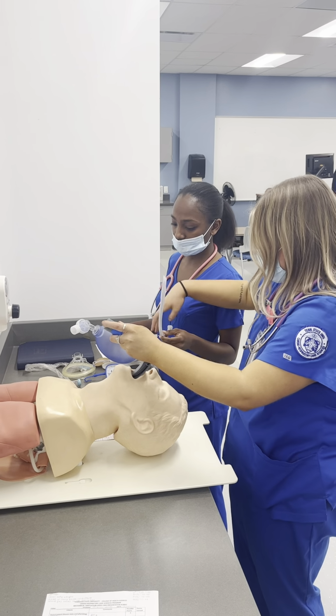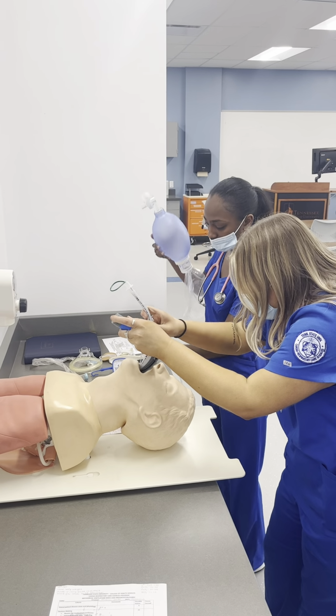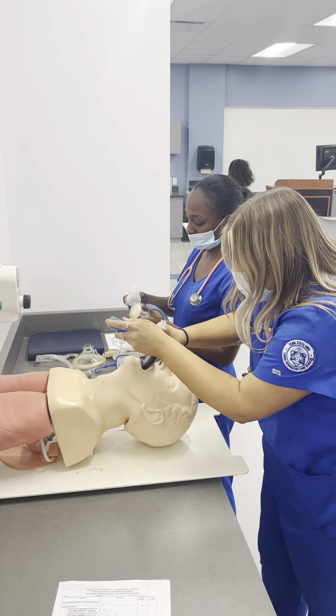And then the ET tube, this is an 8 with the stylet. I'm going to make sure it's at 24 at the mouth so that it is the right depth for this size ET tube. And then I'm going to check for chest rise and use a CO2 detector to make sure that we are in the right spot. So we have chest rise and we have a positive CO2. So we're going to go ahead and inflate the cuff now. I'm going to have Shelby do that while I continue to bag the patient.